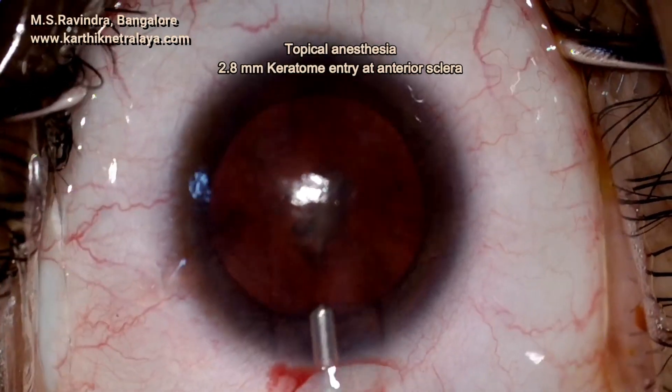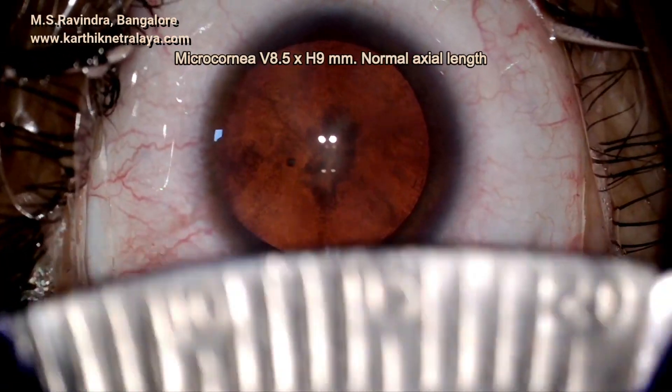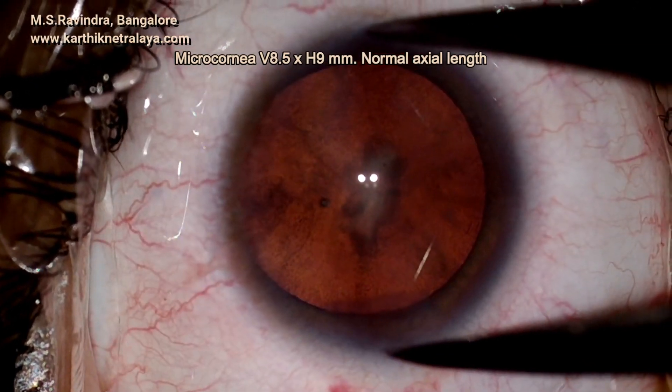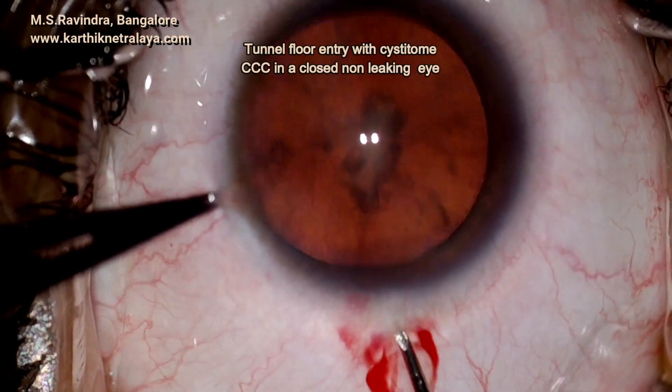A 2.8 millimeter keratome is used to make a sclerocorneal tunnel on the temporal side. The surgery is being done under topical anesthesia. The horizontal white-to-white is 9 millimeters and the vertical is about 8 to 8.5 millimeters.